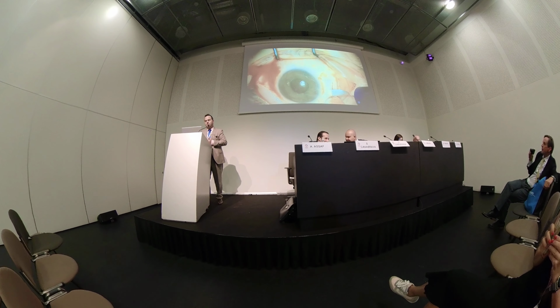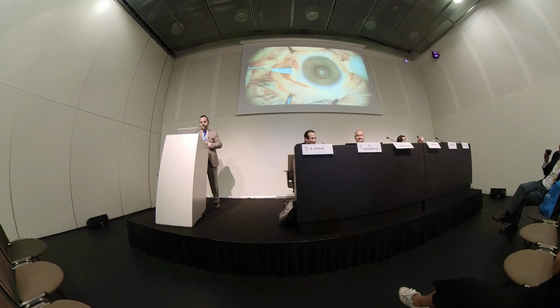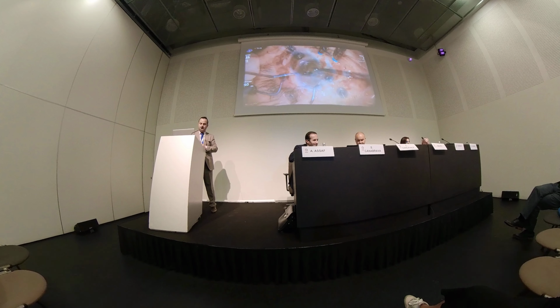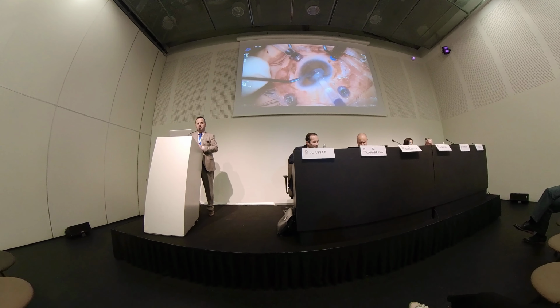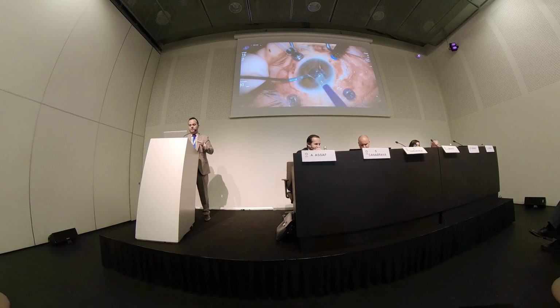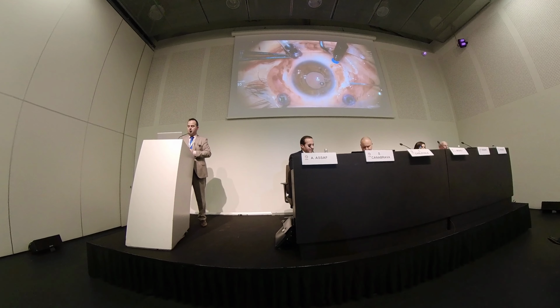tunnel is advanced to 2–2.5 mm from the limbus. The idea is to cover the suture with sclera so that it is not seen under the conjunctiva at first, and to avoid any erosion of the conjunctiva. This is not actually the case with Gore-Tex because Gore-Tex is tissue forgiving. But anyhow, it's more aesthetic and I think more secure for the sutures to be covered under the sclera. The other thing is that this will also address possible hypotony after the surgery.